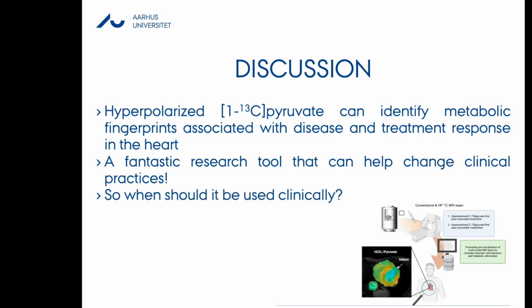And so it's an opportunity to democratize and make hyperpolarization broadly applicable to a lot of patients that would not necessarily get the best opportunity to see these tools. So that's where I see hyperpolarization helping these patients immediately or in the close future. Of course, we don't know exactly which diseases or indications this will eventually be used for mostly, but I believe there's certainly already sufficient evidence to support this in situations where you don't have access to all the fancy PET tracers, but you could easily install a hyperpolarizer in an MR suite somewhere.